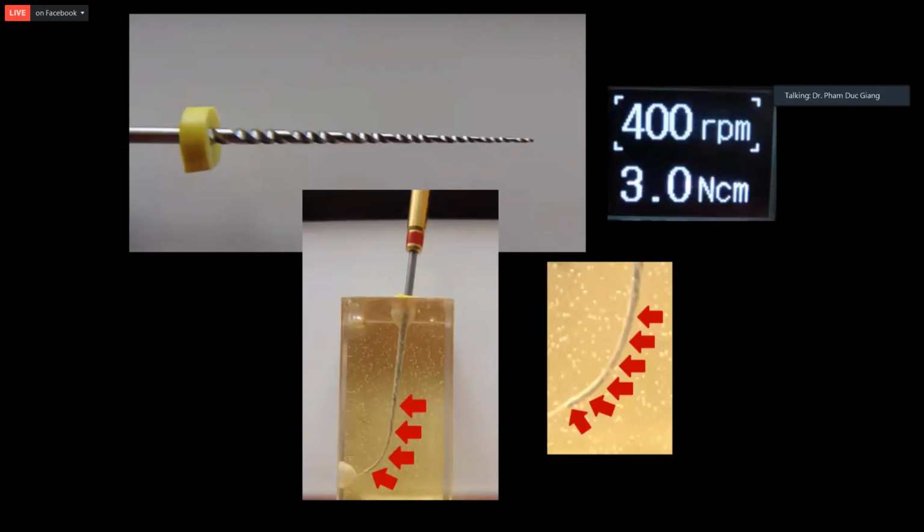3.0. This file is the size 25 taper 0.04.